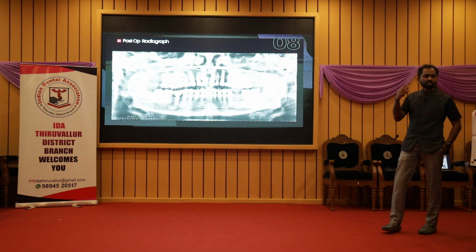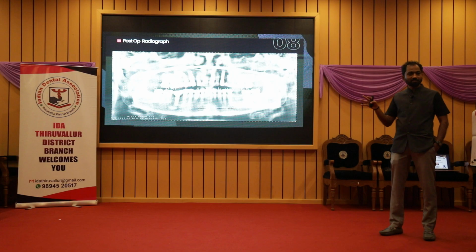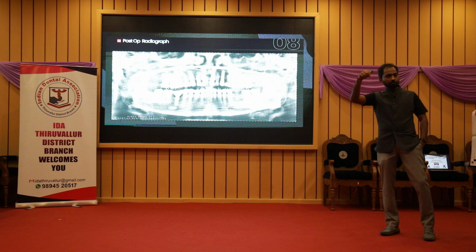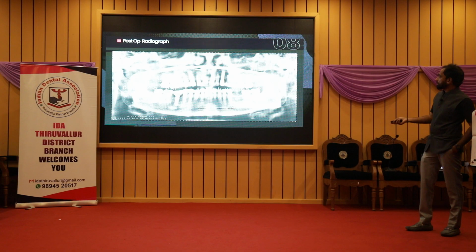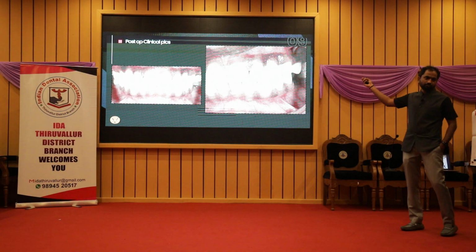When you have two adjacent teeth together, you will always be in parallel. Your parallelism will go when there is no reference. So that's why you are always asked to keep the paralleling pin and then go to the next. If you have two teeth next to each other, then I don't think the parallelism will go wrong. So even I didn't go wrong because of that. So it worked. And that is the kind of process.